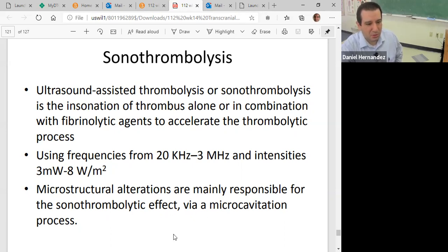So in the peripheral vascular lab, we use it for the small peripheral arteries of the leg. We inject the contrast and we image the contrast coming down the leg. And we put the transducer over the area that we want to increase perfusion of, and we keep the transducer there as the contrast works its way down the leg. The ultrasound will activate that contrast and create microcavitation and help to break up some of that plaque and increase perfusion.